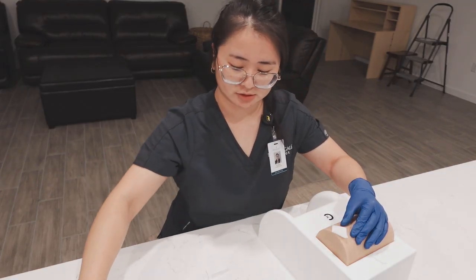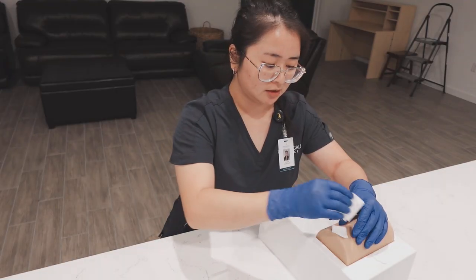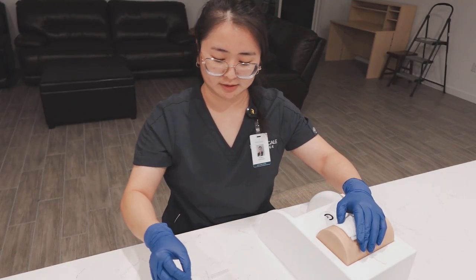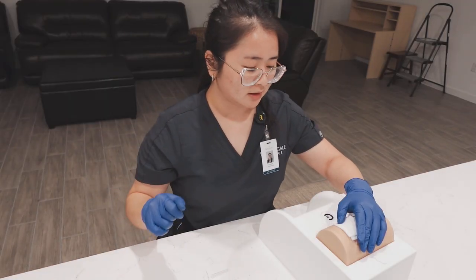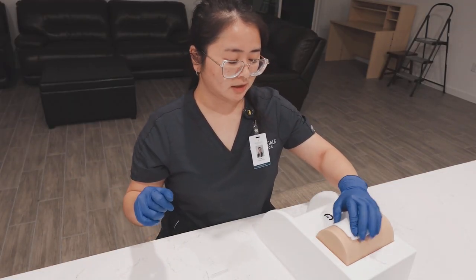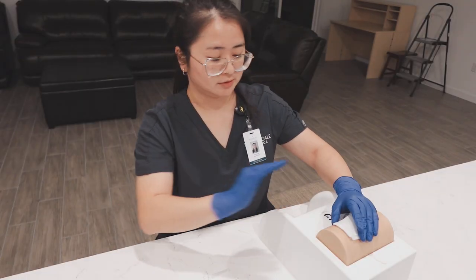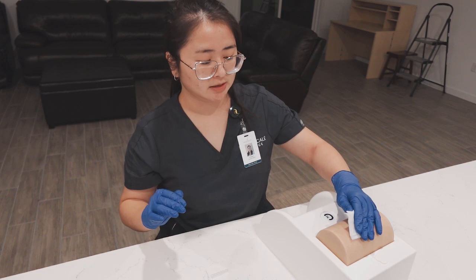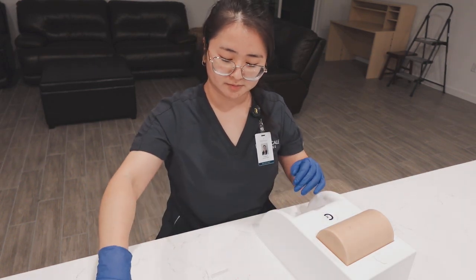We're going to dispose of this in the sharps container. We're going to gently put the gauze on top. We don't put pressure. We don't want to rub it or anything like that. We're going to dispose of this. And we want to make sure we don't rub it or massage it. Now we're going to make sure the patient is not bleeding. He's not bleeding, so he does not need a Band-Aid.